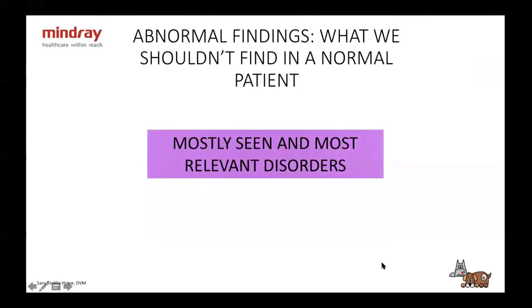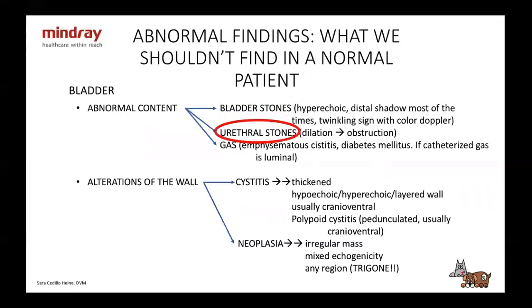Now we'll go through abnormal findings — again, the most commonly seen and most prevalent disorders. Starting with the bladder: bladder stones are hyperechoic with a distal acoustic shadow, and you'll find a twinkling sign with color Doppler. For urethral stones, same appearance but in the urethra — if you see dilation of the urethra, there's an obstruction. You might also see gas in emphysematous cystitis or diabetes; remember that if the patient has been catheterized, gas will be luminal inside the bladder.